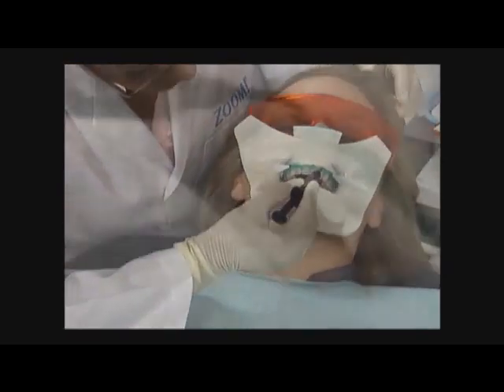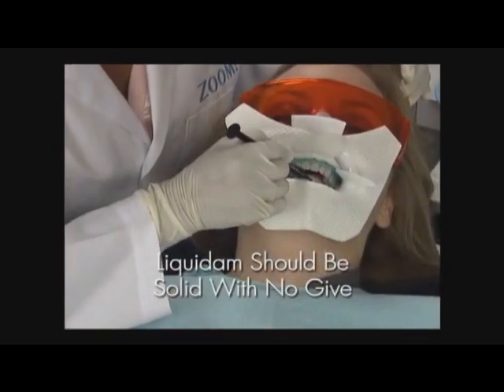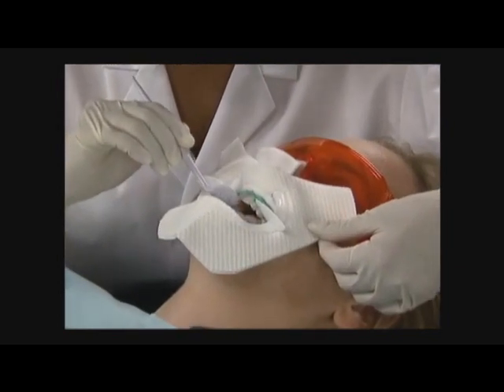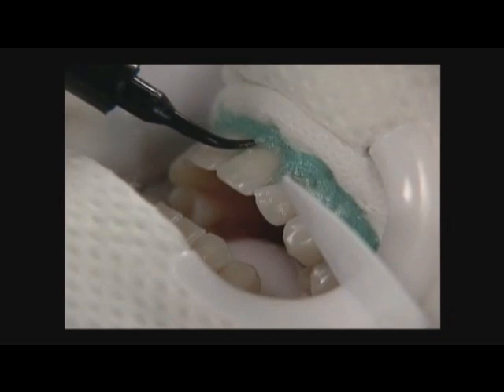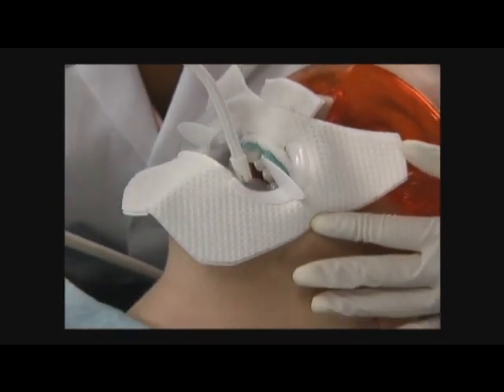Use the tip of the syringe to press lightly on the application to ensure it is completely cured. The material should be solid and have no give. If necessary, cure the arch again for an additional 5 seconds. Check to ensure that all soft tissue is covered and that the gingiva cannot be seen through the Liquidam. If necessary, add additional Liquidam and cure. Use saliva ejection to remove any saliva pooling in the cavity.